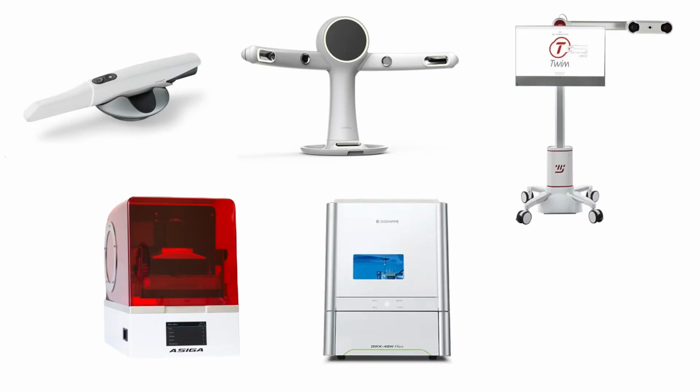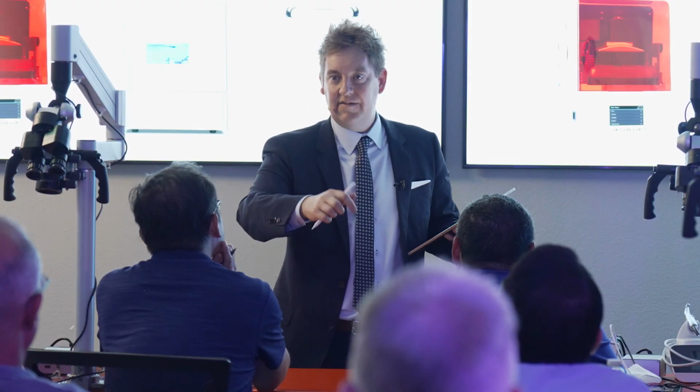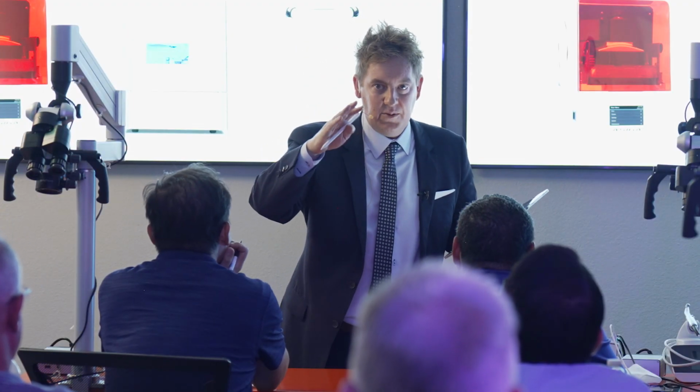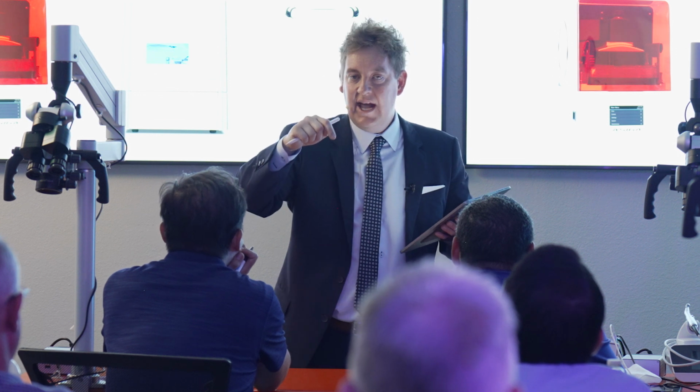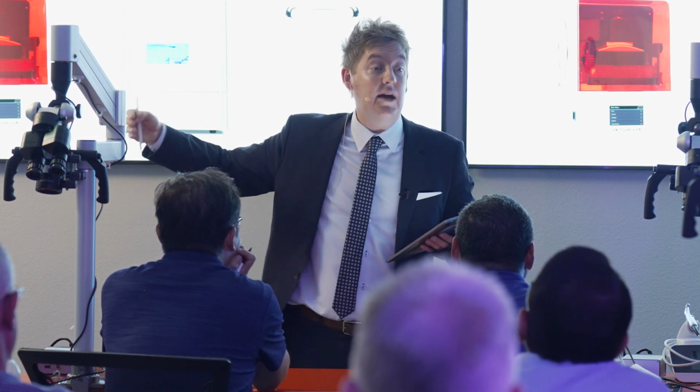And we have a lot of tools today, which we are implementing more and more into everyday practice. How many of you are familiar with Ray Face? It's a facial scanner. It can take a 3D facial scan with 6 cameras in half a second. You sit the patient in front of it, you tell them to smile, they line up with the markers, and you scan them. And then you implement it right into your treatment planning software, right into exocad or 3Shape.